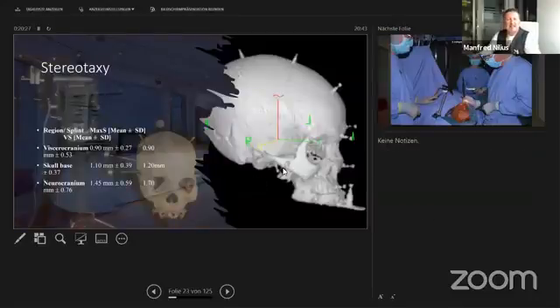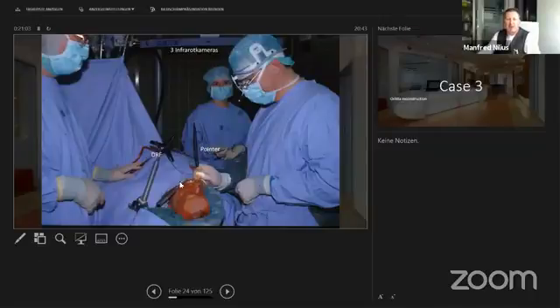We figured out that it's normally for maxillofacial surgery. And when you go with an oral splint, as you can see on the next page, we have an accuracy when we operate in the viscerocranium and the facial part of around 1 millimeter. When you go to the skull base to remove some tumors, you have 1.1 millimeters of accuracy. And when you go to the neurocranium for neurosurgery, you have up to 2 millimeters, 15 centimeters far away from the oral splint. Normally, we use this for maxillofacial surgery or for skull-based surgery.